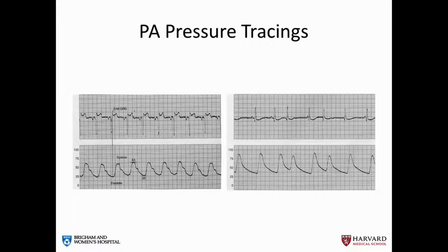These are typical pulmonary artery pressure tracings and how we measure them. Generally, we use the same calculation for mean pulmonary artery pressure as we do for mean arterial pressure. That is the systolic pressure plus 2 times the diastolic pressure divided by 3. Just like with the CVP, we measure it relative to the EKG, and things are a little bit further downstream, and this reflects ventricular contraction. So you can see here the QRS should line up with the beginning of the systolic upstroke of the pulmonary artery pressure waveform. This is just another example of pulmonary artery tracing, and this just shows you the effect of an extrasystole here, which results in some decreased filling, which is reflected in the decreased size of the waveform.